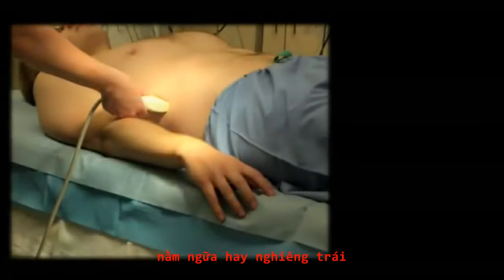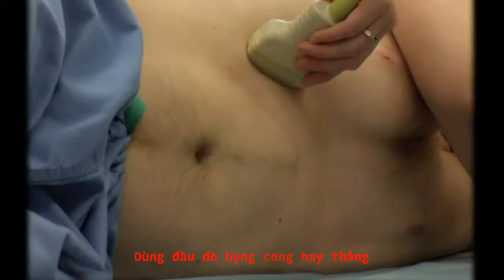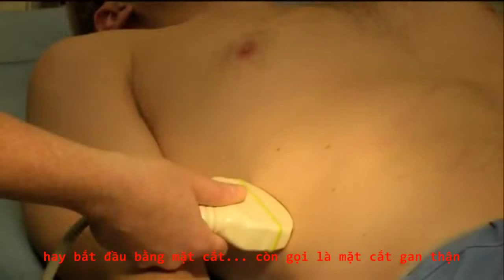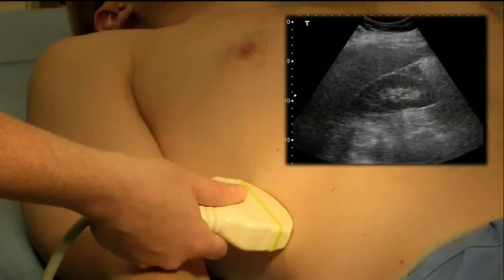The patient should be positioned supine or in the left lateral decubitus position. If unable to get a good view in one position, try the other. Use the abdominal probe or curvilinear probe in a longitudinal position either at the right upper quadrant or starting in Morrison's view, also known as a hepatorenal view from the FAST exam, with the marker aimed cephalad. Starting at Morrison's view may help orient you to surrounding structures and help lead you to the gallbladder.